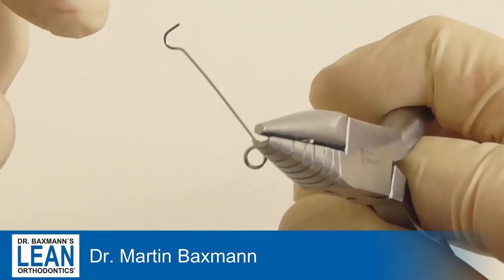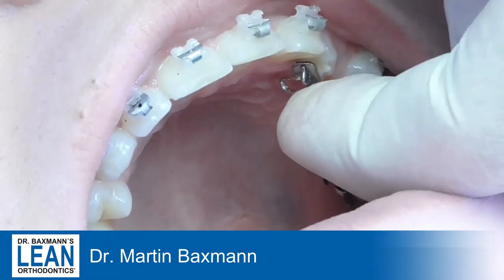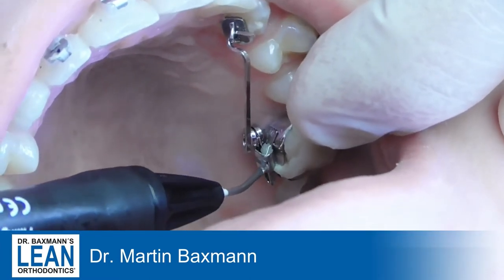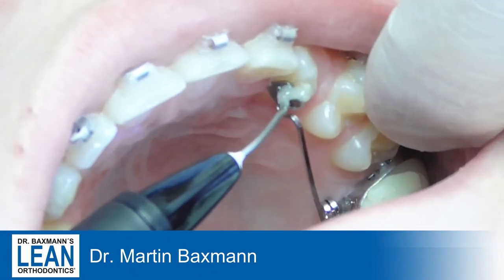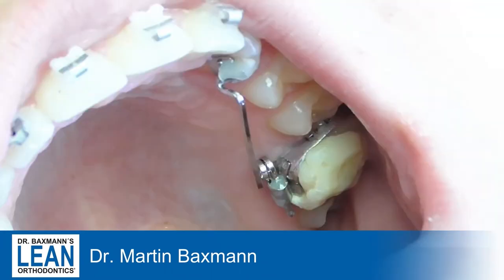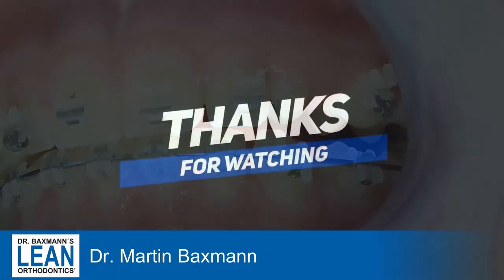Then we bend a U-formed part which will be used to attach the canine — either a gold chain, elastic chain, or even a cleat of the canine. Now we've got it inserted and activated. We put it in the palatal slot of the molar, fix it with some bonding, and attach it to the cleat on the canine with some bonding or composite — that's Tetric Flow that I used — and now it will extrude nicely.